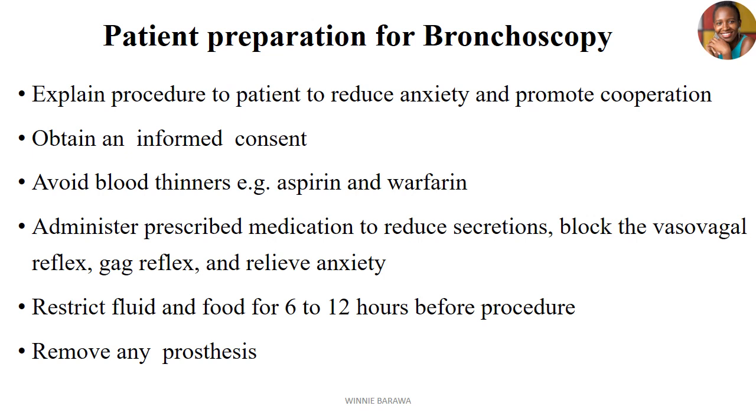Then remove any prosthetics that might interfere with the bronchoscope as you are going in. Also, because the bronchoscope partly carries along with it some magnetic tools, and you don't want this to be interfering with the prosthetics.